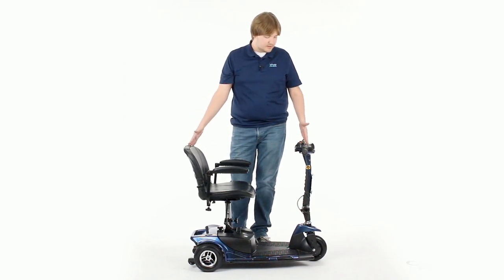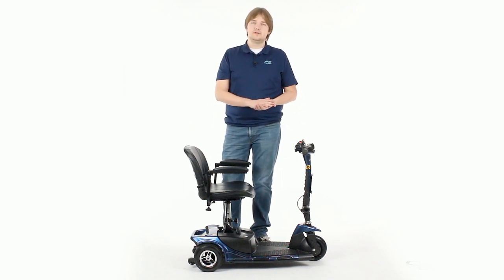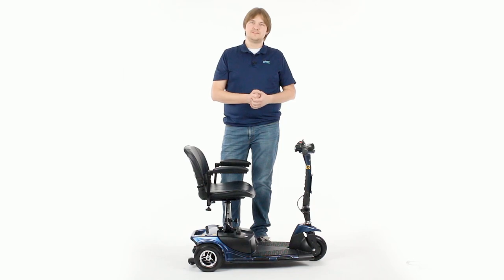You'll be all set, ready to ride. The device is very easy to get accustomed to. After a very short time, you'll be very comfortable on it. Thanks so much for watching. Give our video a thumbs up if it's been helpful.